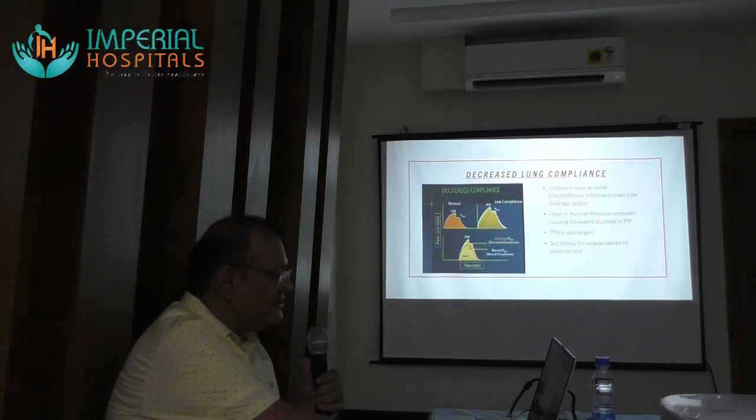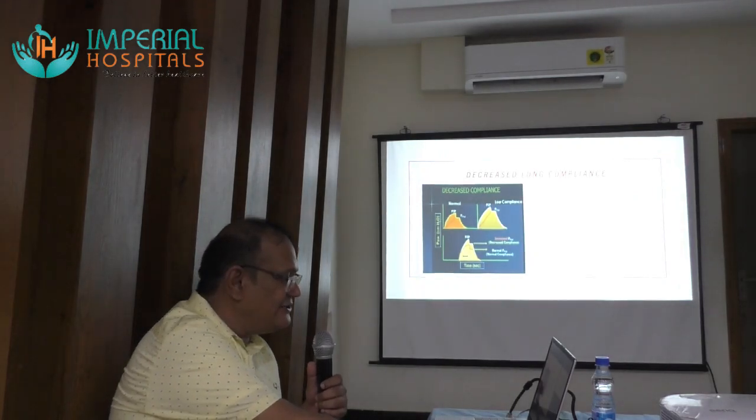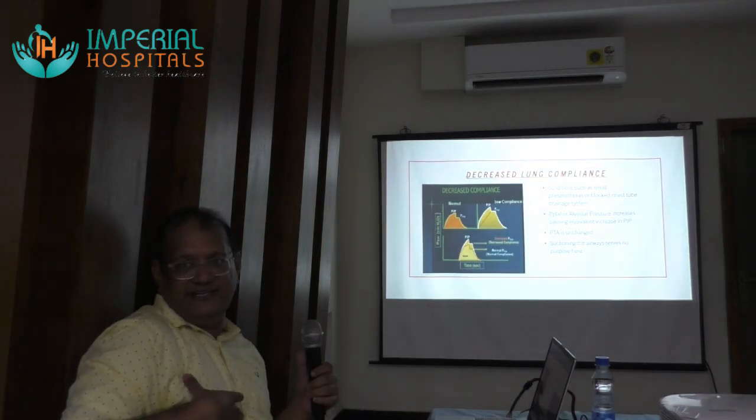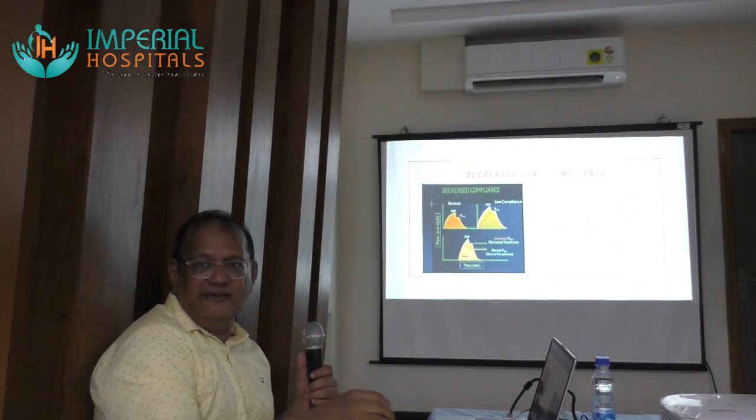So both PIP and P plat are increased, but the airway resistance is not changed much, right? So plateau pressure has increased. In these cases, because the compliance has changed, there is no obstruction in the airways. Suctioning here will not be useful.